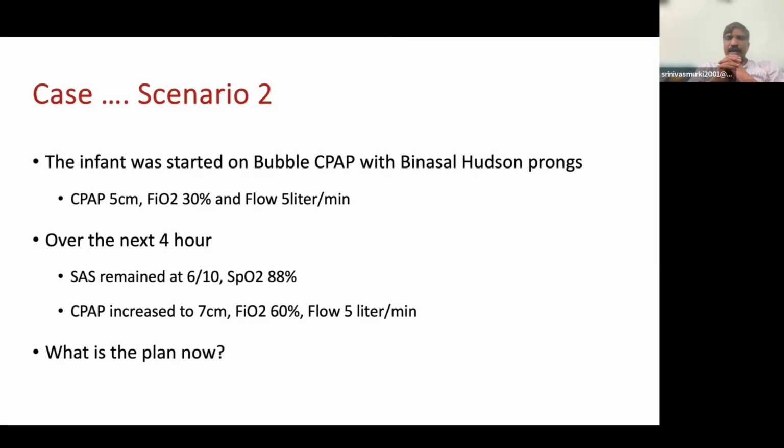Okay, so CPAP fail is very good. Mechanical ventilation, okay. Nasal IMV is another option, very good. Intubate and mechanical ventilation. Okay, so these are the options. Yes, we can either continue the baby on CPAP, so we need to see how we continue, or we can switch over to nasal IMV, or we can go to ventilation.